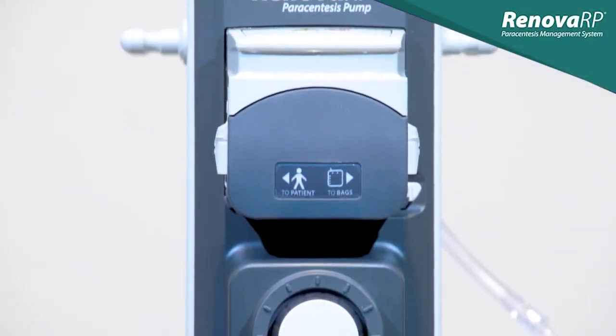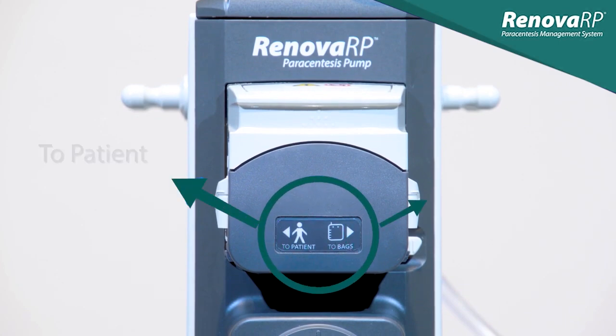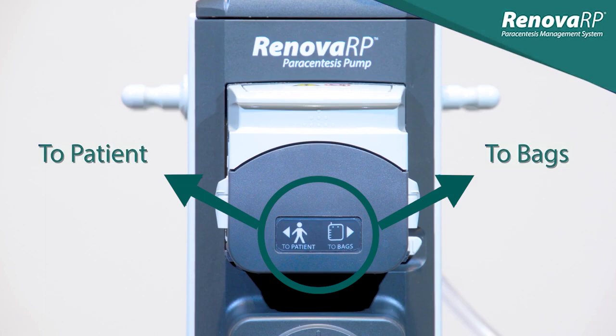Using the indicator on the front of the pump head, we can see how to properly load the tubing. When facing the pump, we see that the tubing should go to the bags on the right and to the patient on the left.